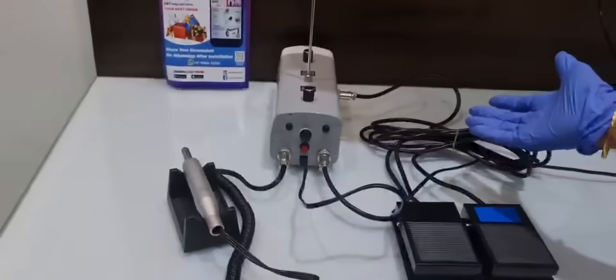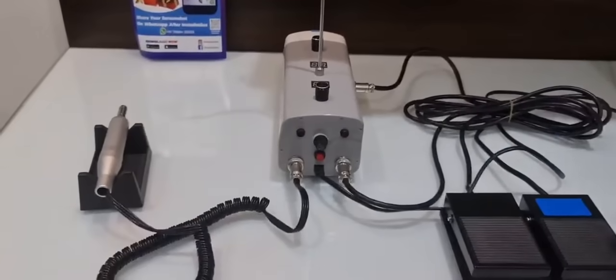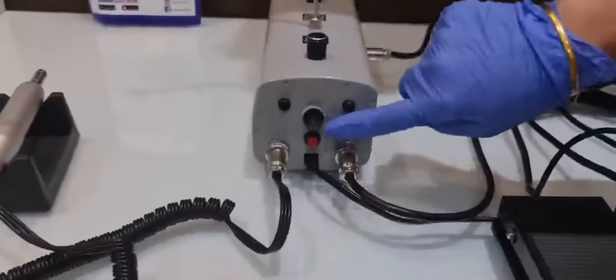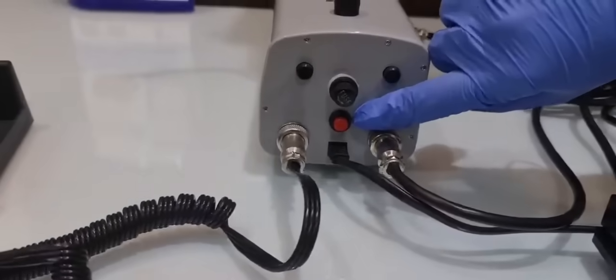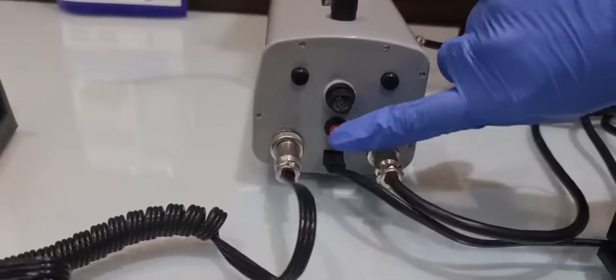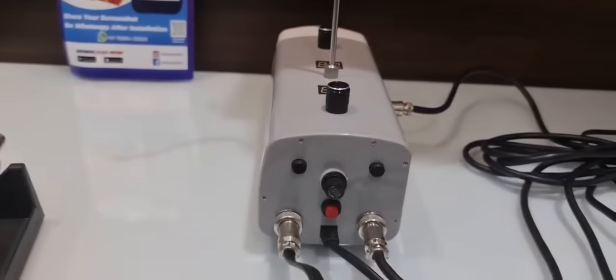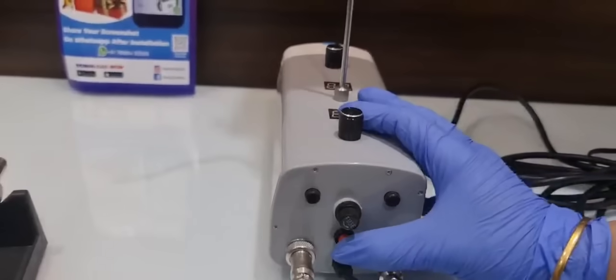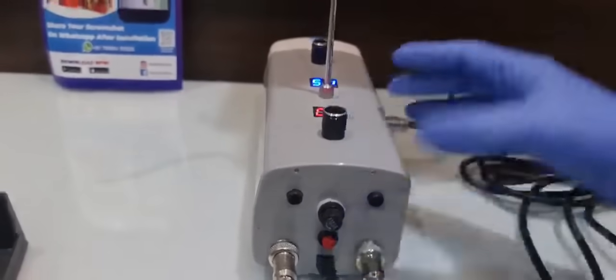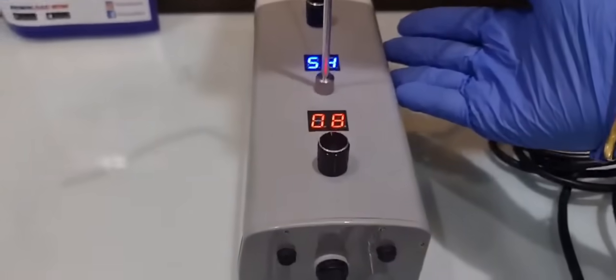Now let's see the functioning of this motor. There is a red button over here which is used for power on and off. Let's switch it on from the back first, then you may press it. Now you can see that the motor has started to work.